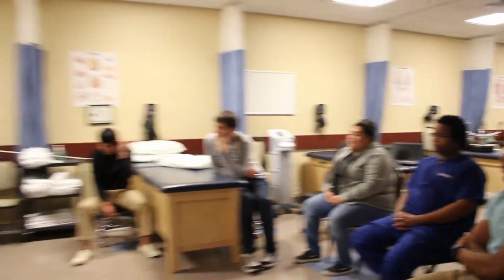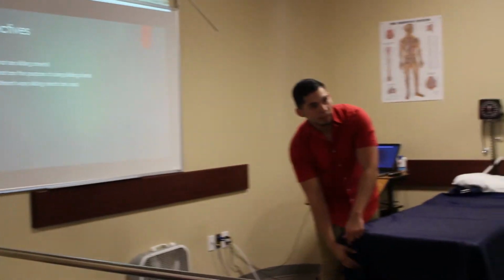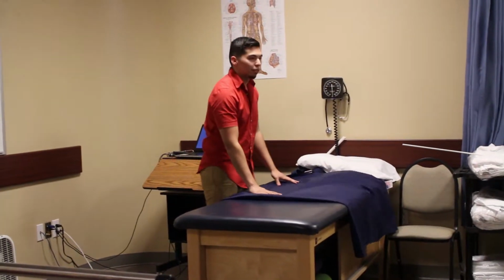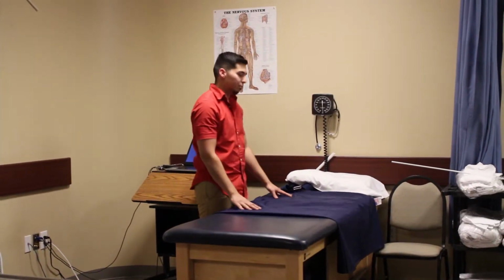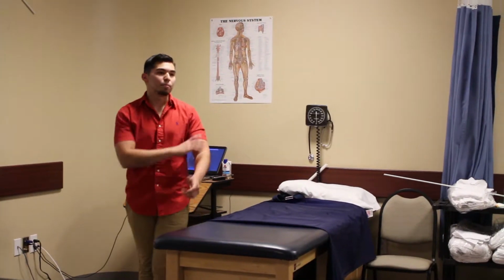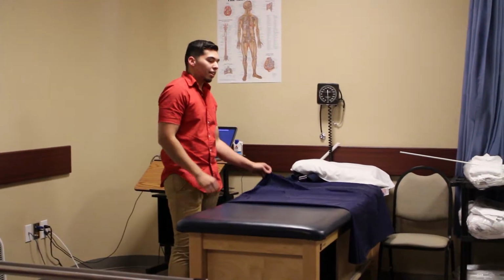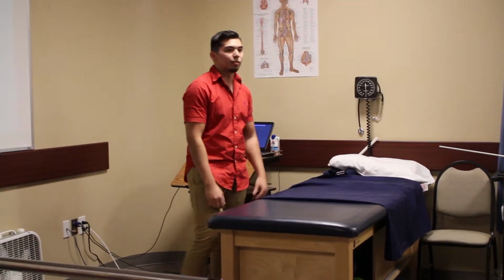So I have a question for you. Yes. Is that a one-person thing, or can 2 people use it, or how does that work? Well, the ones I demonstrated to you was one person. The reason why I folded it in half was so you could cause that low friction action where the sheet slides within itself. If it's a heavier person, you might want to use 2 people and also 2 sliding sheets, so you cover the whole person and you could still have that low friction movement.